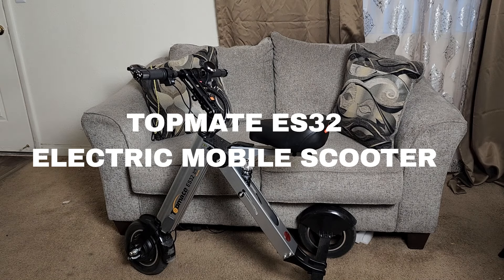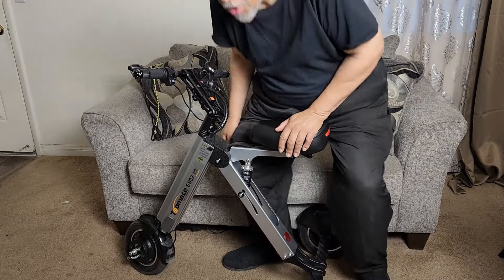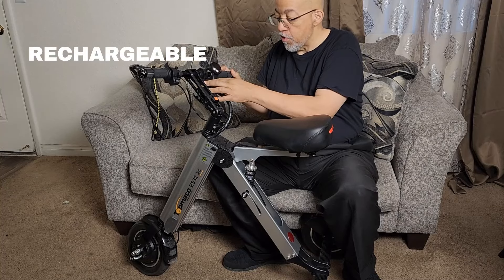This is the Topmate ES32 electric mobility scooter. I've charged it up once about a month ago. I don't use it a lot, but I do use it to get to work. I can pull it up and take it with me, charge it up. It has reverse mode.